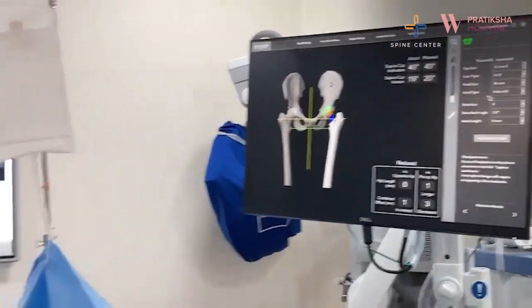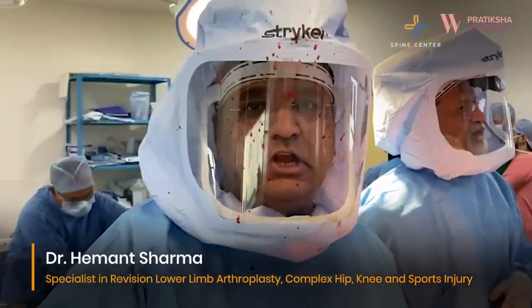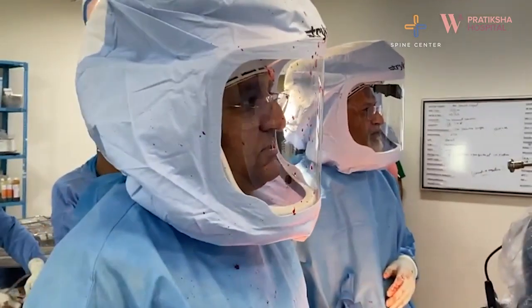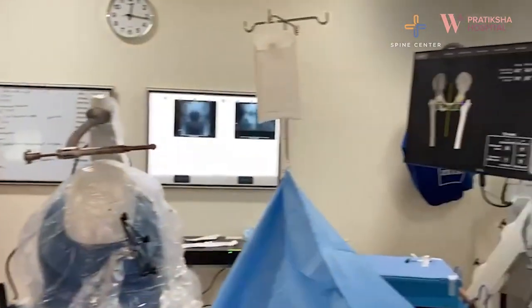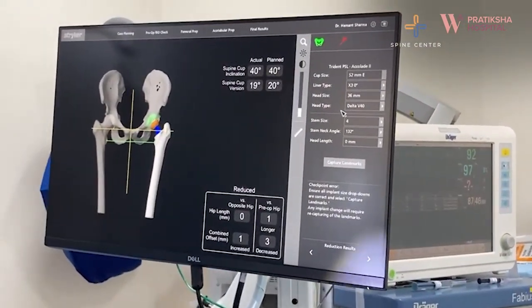We have reduced the hip. We check the hip length according to the pre-op leg length discrepancy — zero. So we are 100% equal. And even the combined offset pre-op and in the opposite hip, there is hardly any difference. So it's a perfectly balanced, stabilized hip.